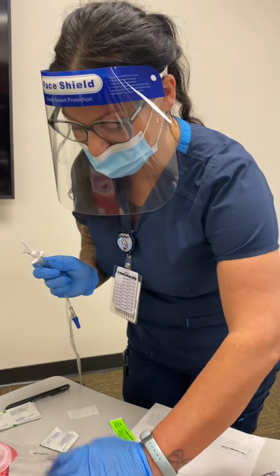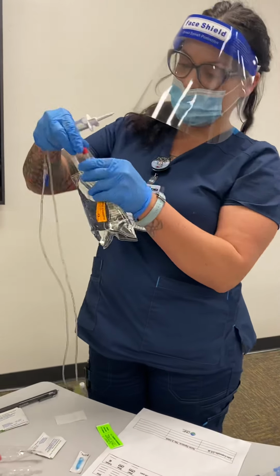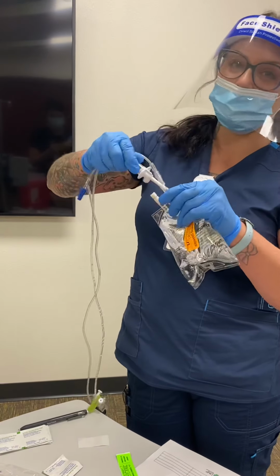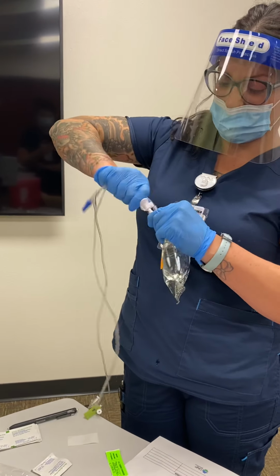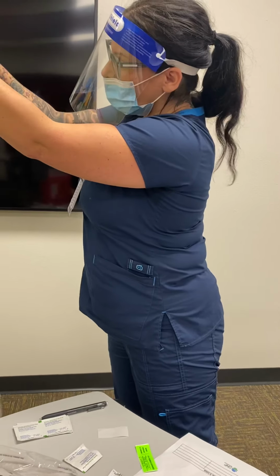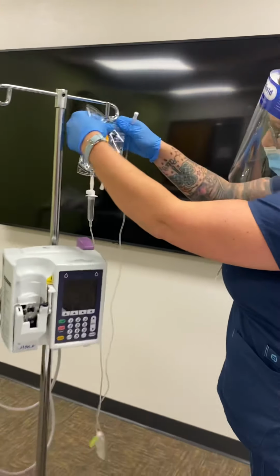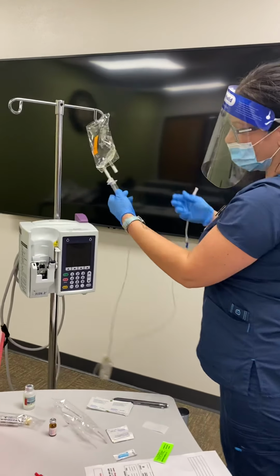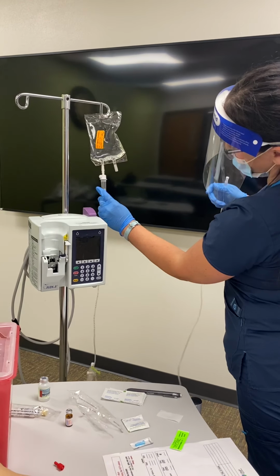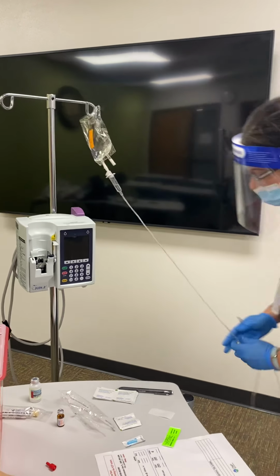All right, so we would get our bag, pop, insert. Way better than that, without touching anything. Hang the bag. Fill your drip chamber halfway on your tubing.